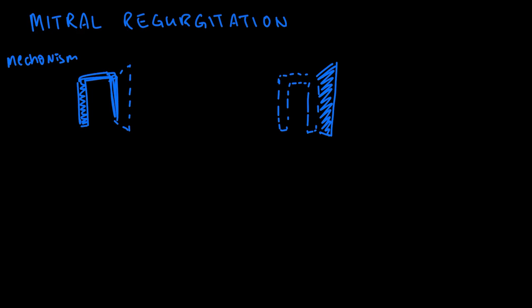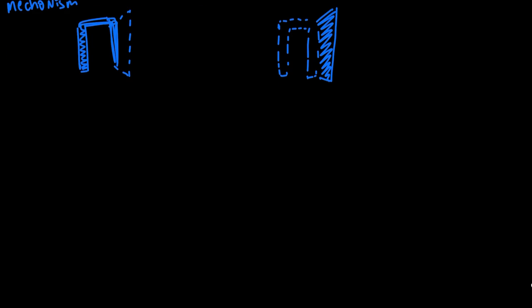And so if we say that the problem is with the door frame, what does that mean for the mitral valve? Well, let's look in our apical four-chamber view. You've got your left atrium that empties blood into your left ventricle, and then over here you've got your right ventricle and right atrium.